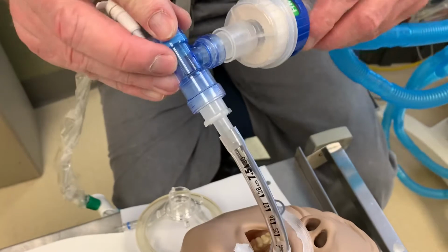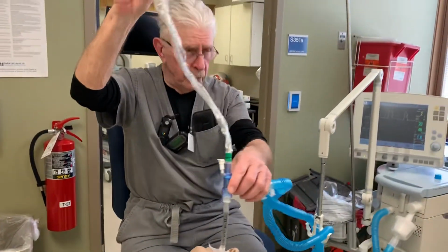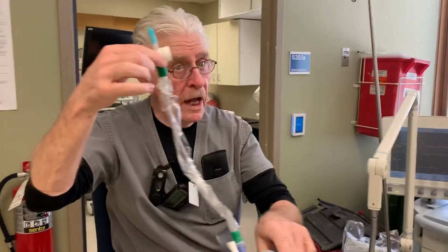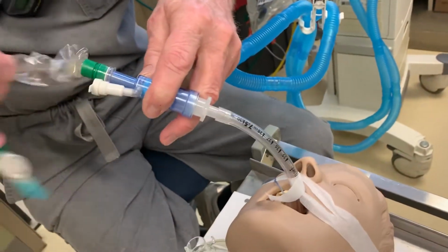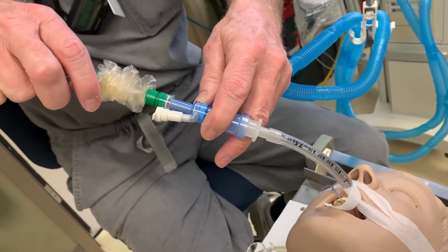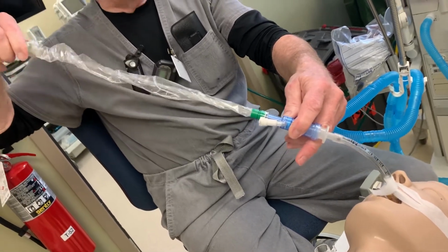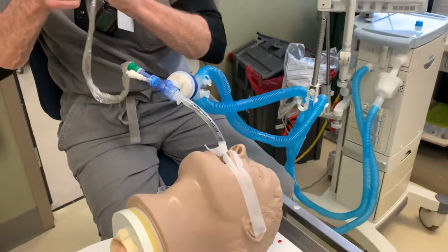So when you were to use this suction, it's usually characteristically somewhere around 100 millimeters of mercury, you would turn the suction on, like so, and then insert this, as you would characteristically with suction, until you meet a restriction. Then as you withdraw it slightly, apply the suction intermittently while rotating the catheter as you pull it out. All right, then once you're finished with that, you turn this off.